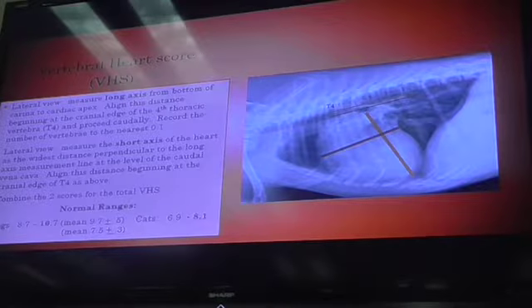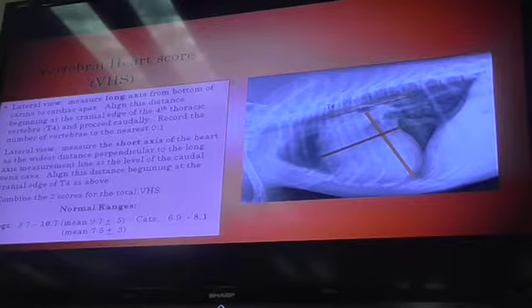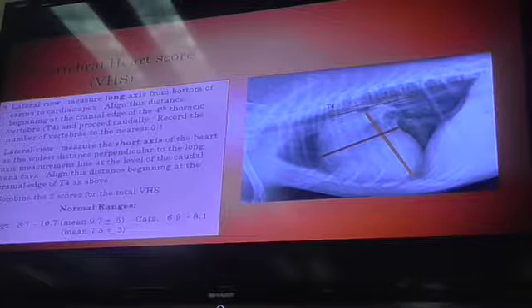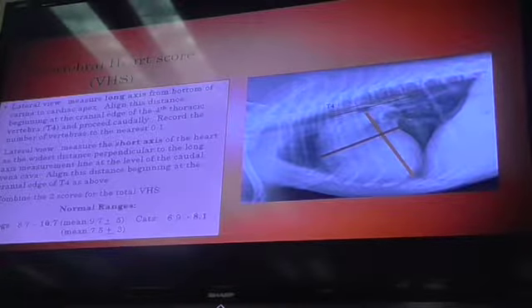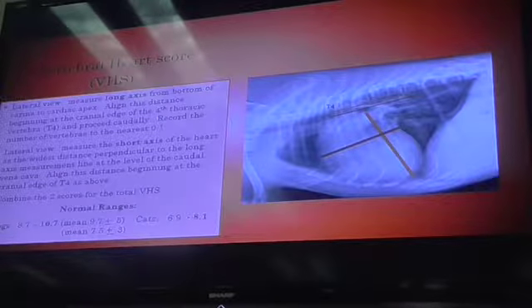Okay. So if you were at your computer, you would do something like this, tick, something like this, tick, and then put them up here and count to your tick mark. That's where I was going. Yeah, and that's fine. We're gonna practice this because it does get a little confusing until you have had it a couple of times. All right.